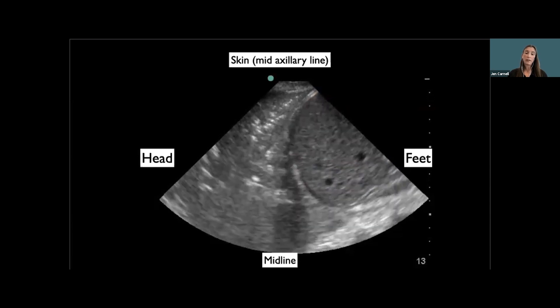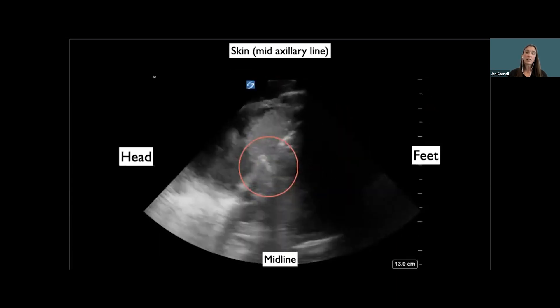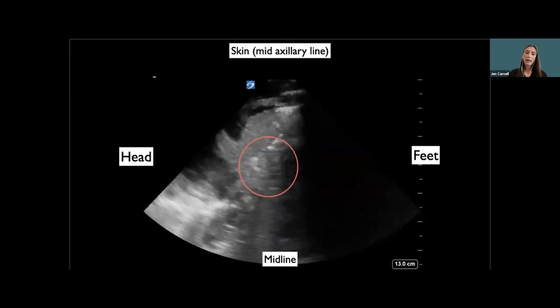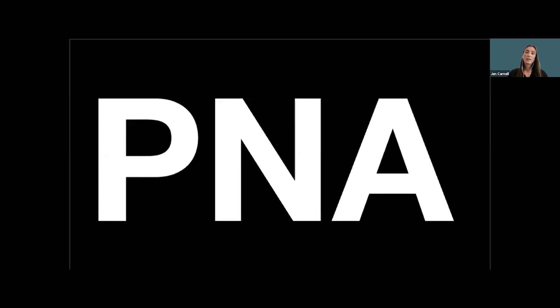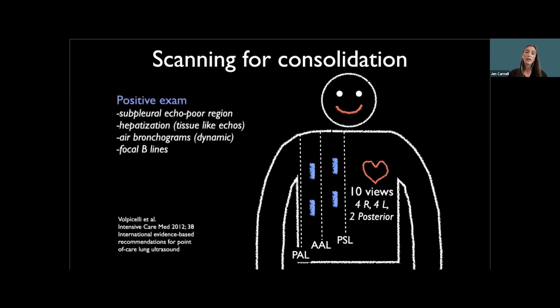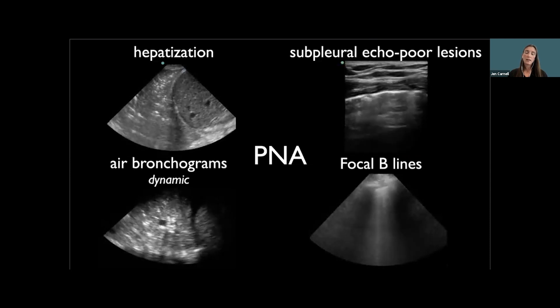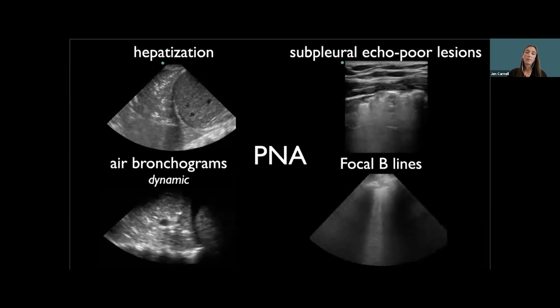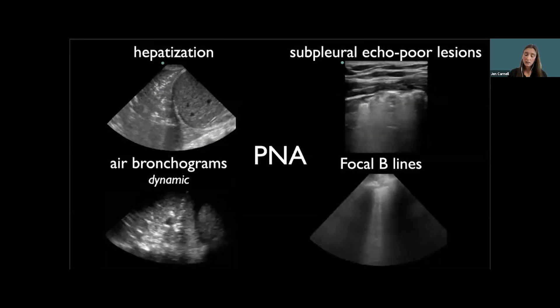This is hepatization of the lung — an abnormal finding most often seen in pneumonia. You might also see dynamic air bronchograms: bright white dots that are actually moving up and down. Dynamic air bronchograms are very specific for pneumonia. Scanning for pneumonia isn't easy since it's patchy and potentially focal — you've got to scan both anterior and posterior lung zones. But if you see hepatization, air bronchograms, focal B lines, or a lumpy, bumpy, irregular pleural line, those are all signs of pneumonia.